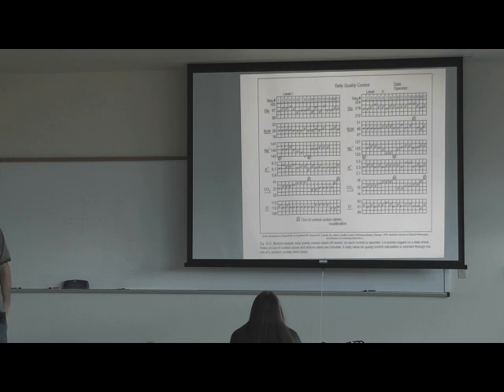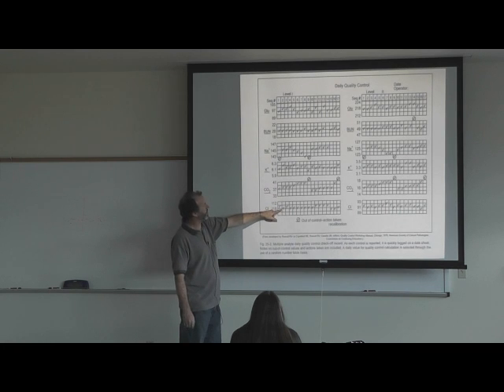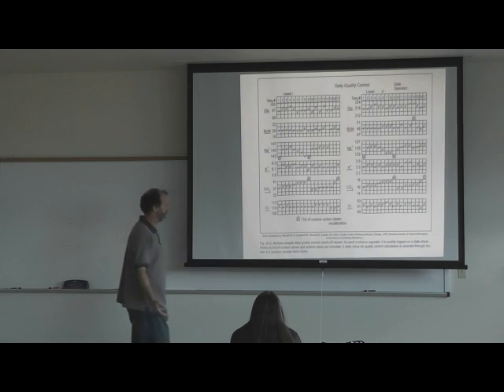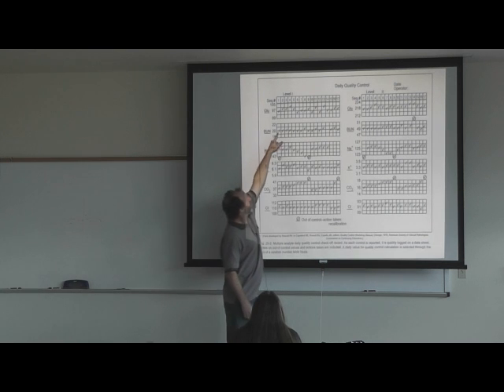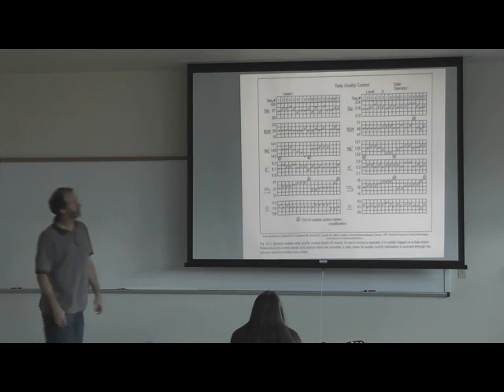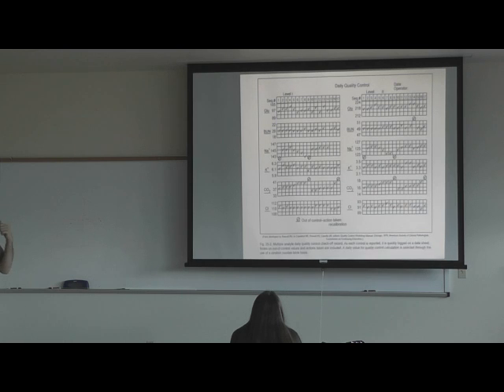So this is an example of your daily quality control runs, and this is from your book, and these are basically your Levey-Jennings charts, right? So for all the different values, these look good, and then these are outside the range. I don't like the figures in this book so much. I like the animations more.